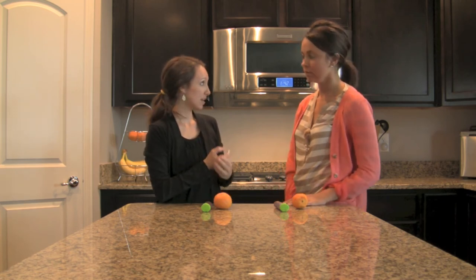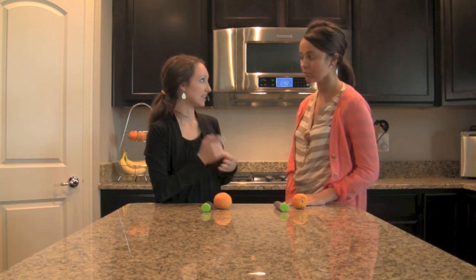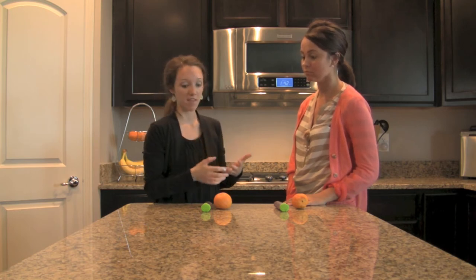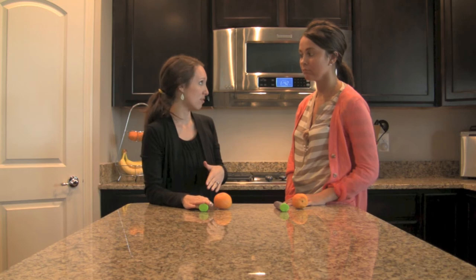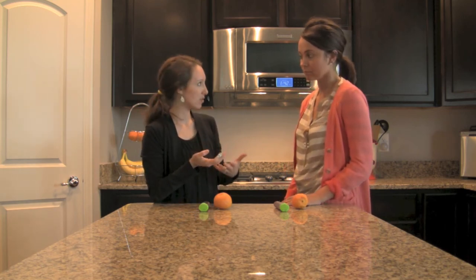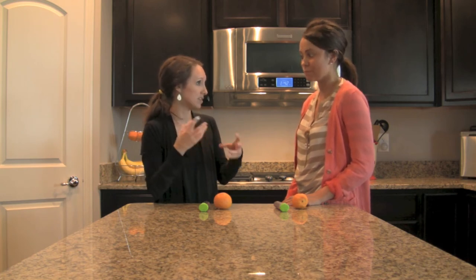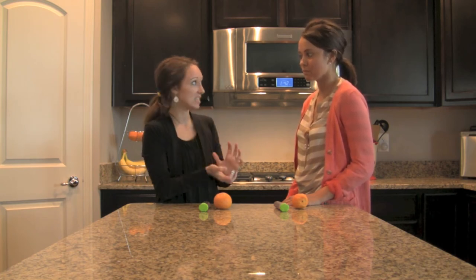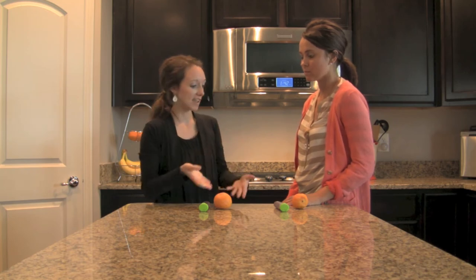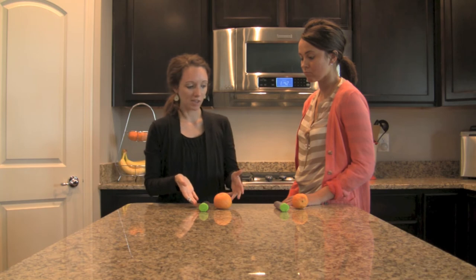I have shown Lindsay with a training device how to use an EpiPen, but as I mentioned it does feel a little bit different, and I wouldn't have known that had I not actually used one myself. I think one of the most fearful things about using one is just the unknown — it sounds so scary when there's a needle involved. This should take a lot of the fear out of it.